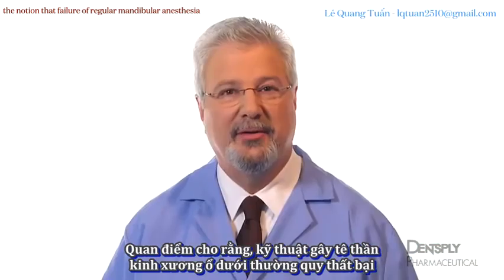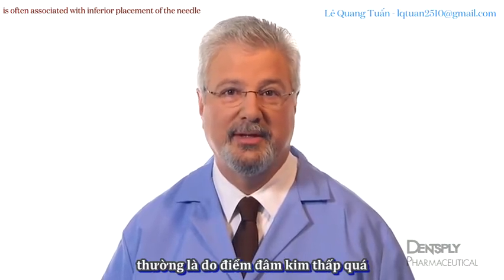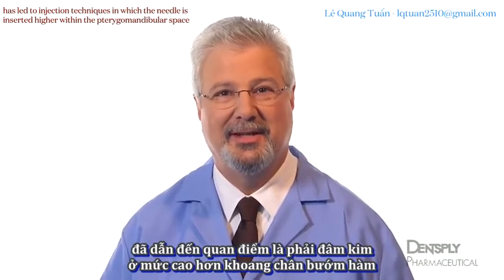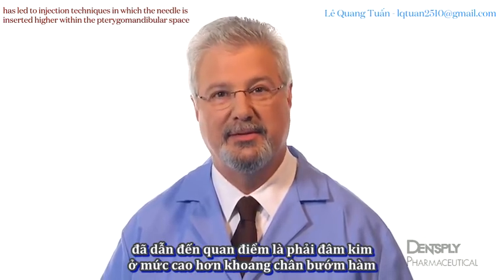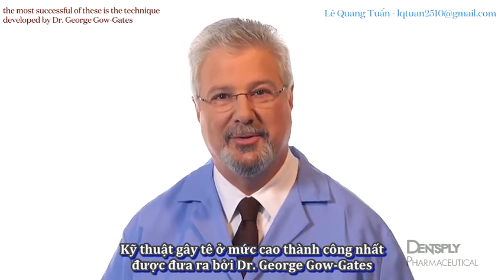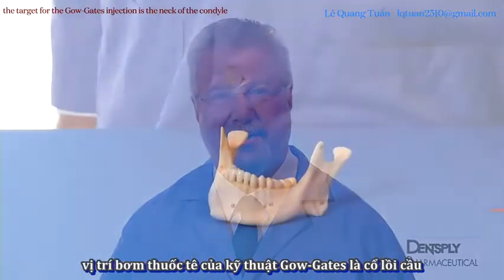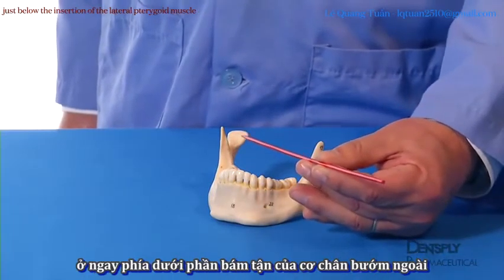The notion that failure of mandibular anesthesia is often associated with inferior placement of the needle has led to injection techniques in which the needle is inserted higher within the pterygomandibular space. The most successful of these is the technique developed by Dr. George Gowgates.